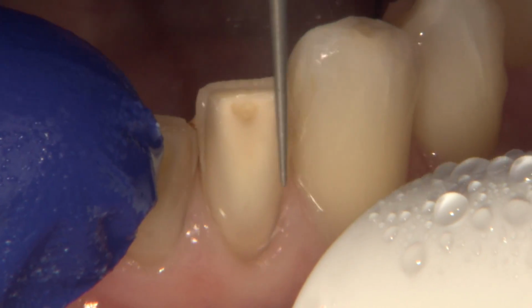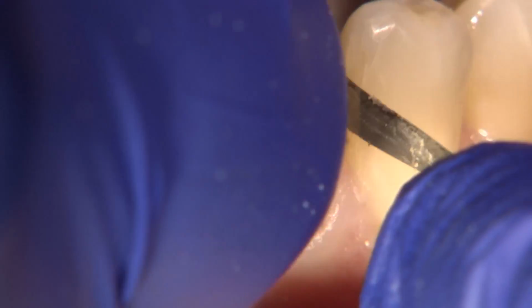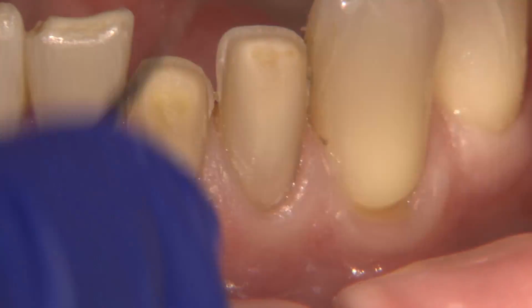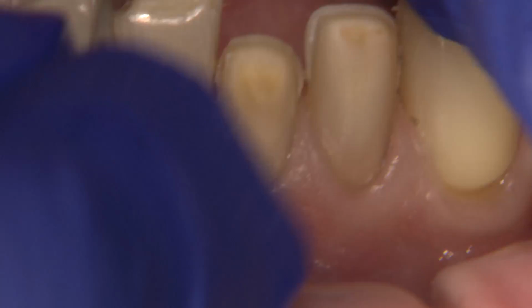To avoid removing too much tooth structure, I use a long, narrow diamond to define the finish line interproximally, and also run an interproximal finishing strip to create some slight separation between the teeth. It just makes the fabrication process much easier on the technicians while also ensuring we get an optimal fitting restoration.